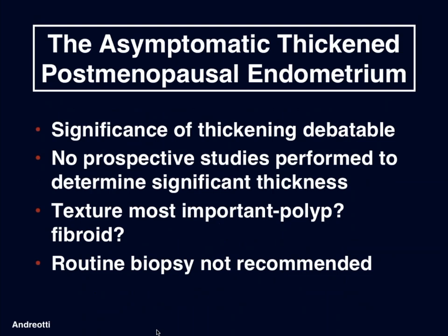So if a patient is asymptomatic then, is not bleeding, is there any significance to endometrial thickening? Actually, thickening of the endometrium without symptoms is highly debatable. There are no prospective studies performed to determine the significance of thickness. And what seems to be more important is the texture of the endometrial echo. Does it look like a polyp? Does it look like a fibroid? So routine biopsy, really, no matter what the thickness of the endometrium is, in a patient who is not bleeding, is not routinely recommended.